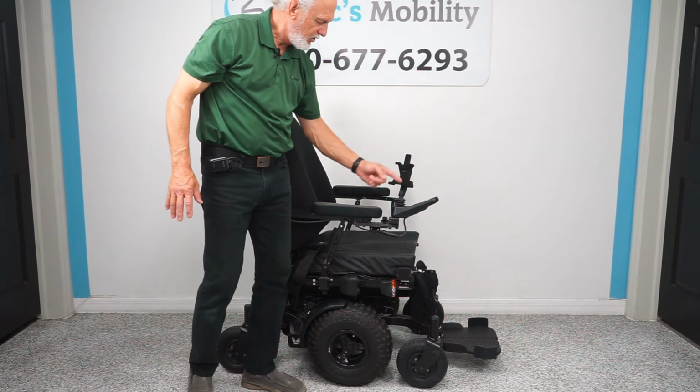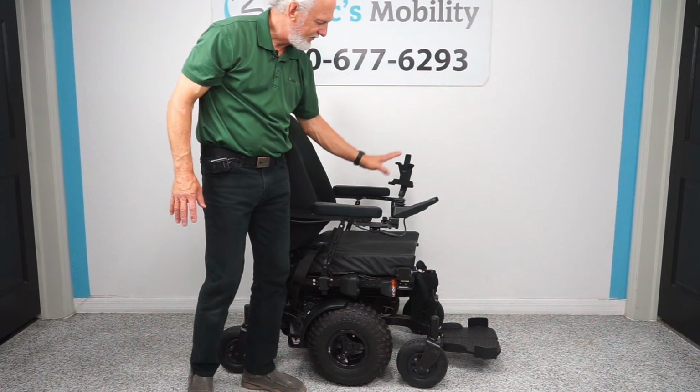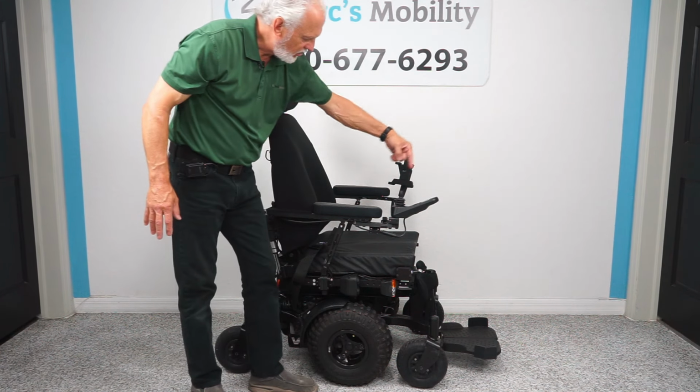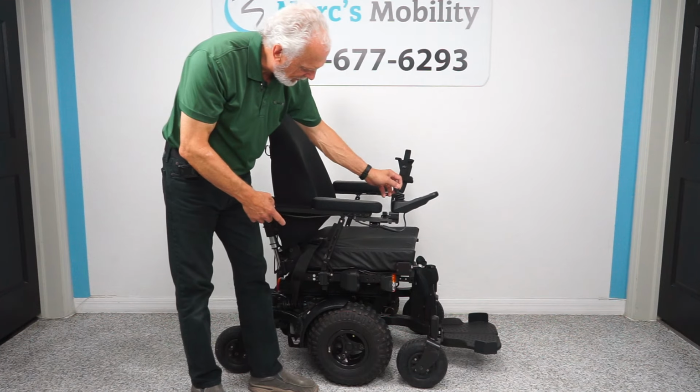So if it's not black, all you have to do is move the joystick sideways. It'll change the colors. So now I have the seat black. So now I can use my joystick. So if I go back, you can see the seat lift starting to go up, okay?